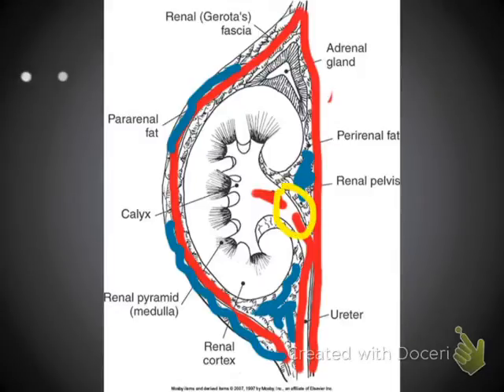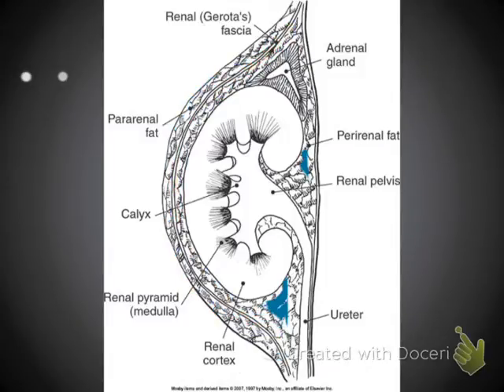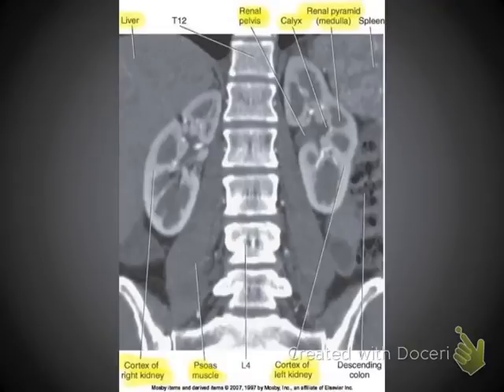here. And so if we'll notice, as we're doing CTs on patients who have a history of renal stones and they're experiencing flank pain, things like that, blood in the urine, a lot of the times you'll see a stone actually caught here in the UPJ. It seems like there's just something about this turn to go down the ureter that sometimes is a little difficult for renal stones to actually do. Once again, everything kind of looks a little different on CT, though. It's not quite as cut and dry.